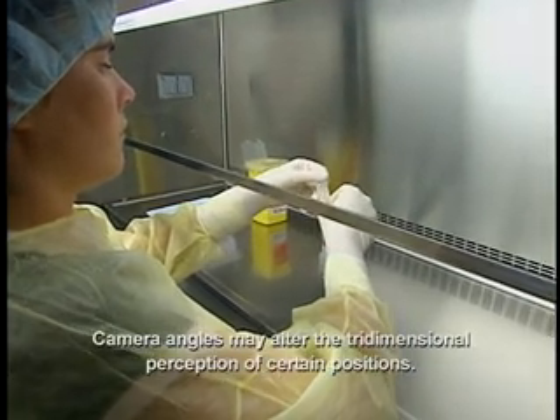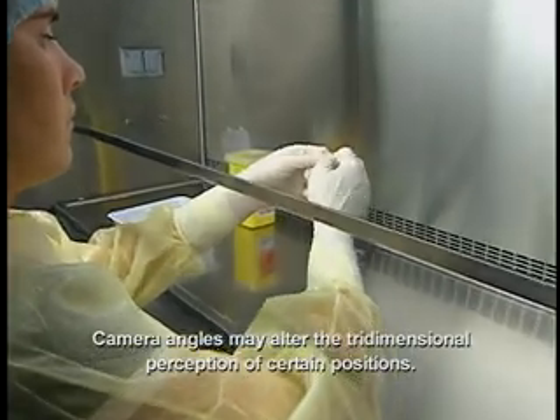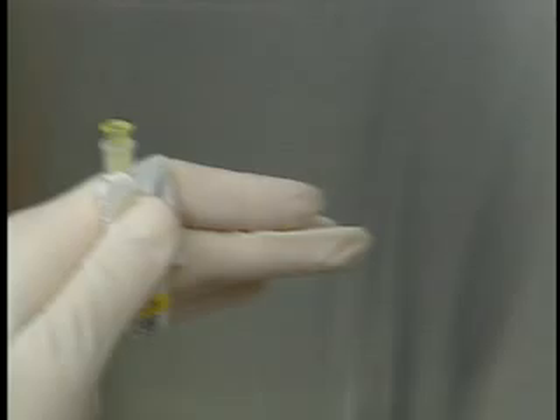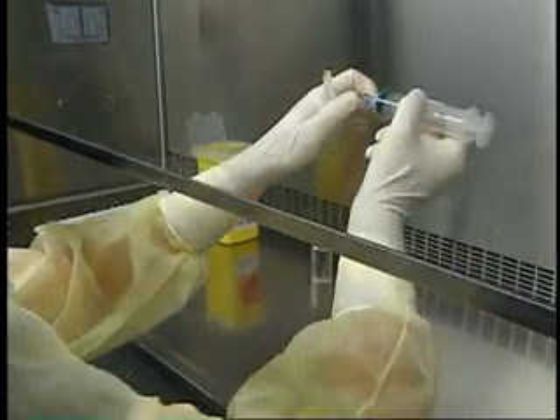Peel back the wrapping on the needle halfway, taking care not to disrupt the laminar airflow over the needle. Pull the syringe from underneath and keep it horizontal, the tip pointing to your other hand.